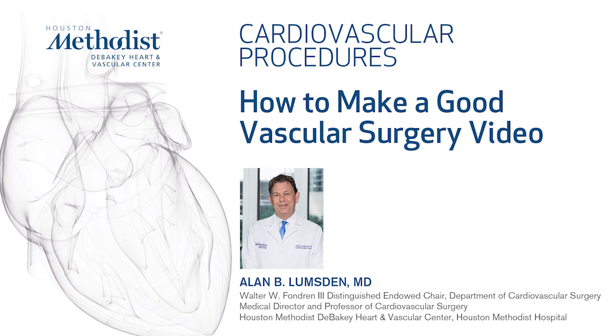In the first half of this video we're going to show you the basic setup — how you can record anywhere using a basic endoscopy tower. In the second half we're going to show how to build this into an integrated operating room.